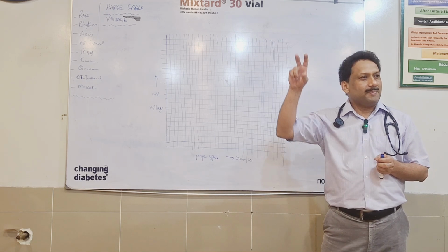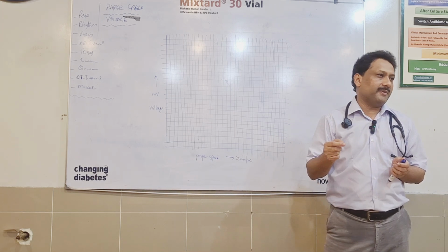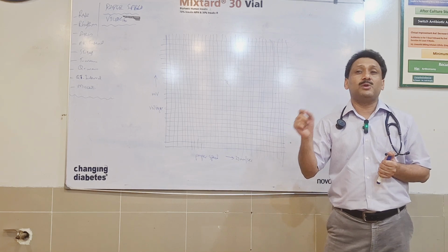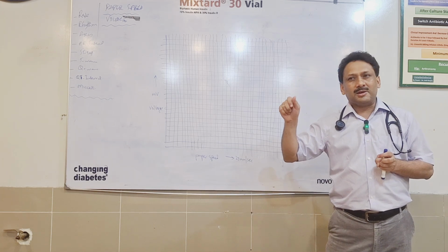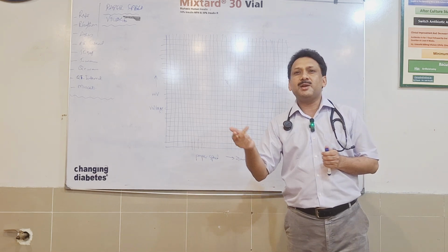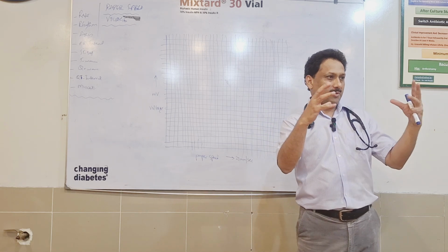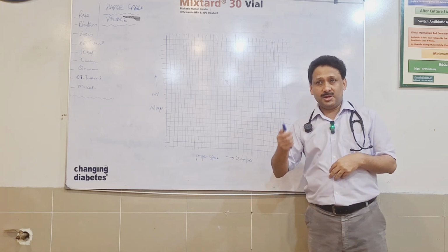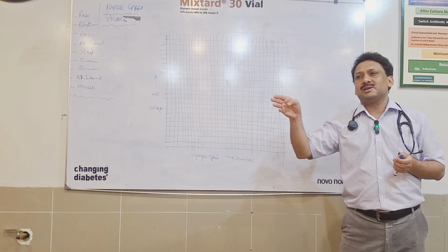That way you forget the basic principles of how to interpret an ECG, and you may miss a few very important and relevant findings. You may miss a few marks, and you basically won't get full marks in exams if you don't follow that order. Following that order gives you a lot of clues. You can pick that a patient is having tachycardia, he might be having a rate of 110, but one candidate was only able to pick ST elevation because he found that big abnormality and started focusing on it only, and as a result he couldn't reach the diagnosis as well as the other relevant important findings.